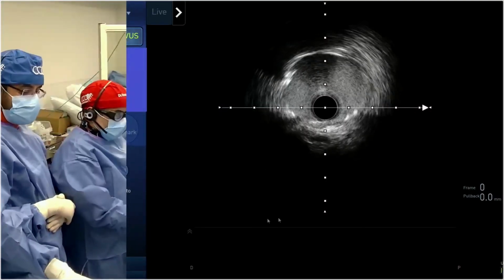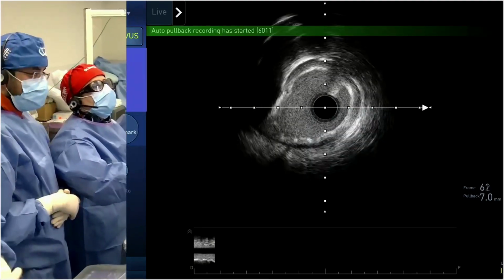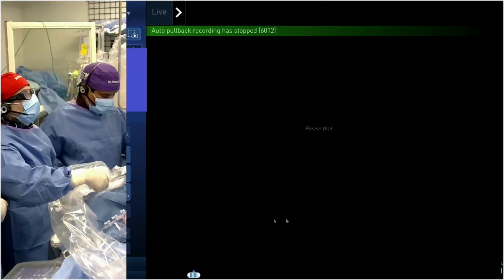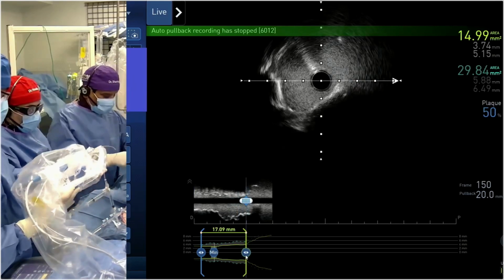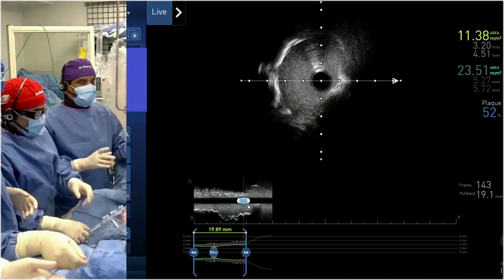One comment for the take-home message today: for calcified lesions, is the better approach always lithotripsy first, and if that doesn't work, go to Rota? Or would you modify that statement that Dr. La Sala said a little bit about? No, I think La Sala said the same thing.